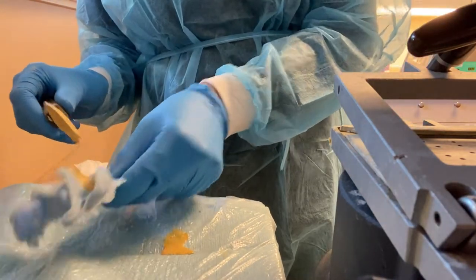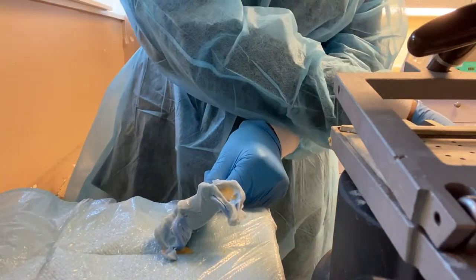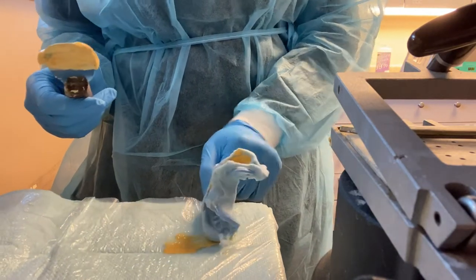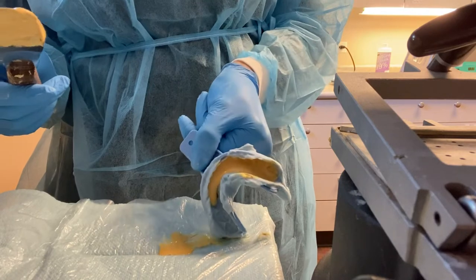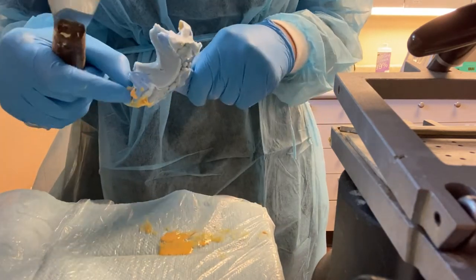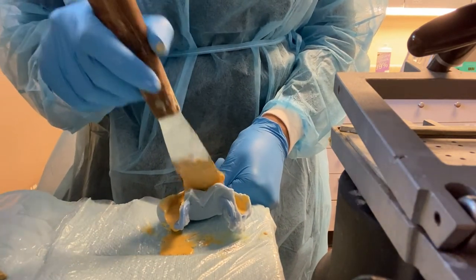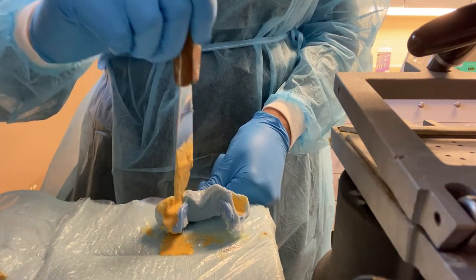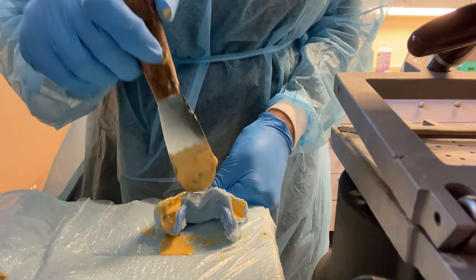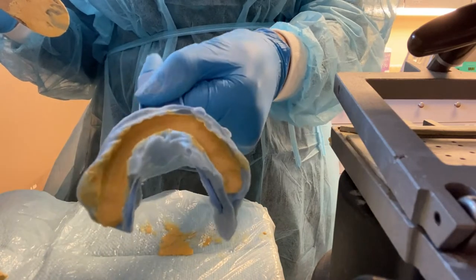How I always do it is when I'm first pouring up the model, when you first pour it into the actual impression, you want to make sure it's a little bit runny. That way it's easier for you to make sure that there's no bubbles. When you get ready to make the base, you want to make the stone a little bit thicker so that the base is stronger. Then once you set your model up, you don't have the stone running off of the impression.